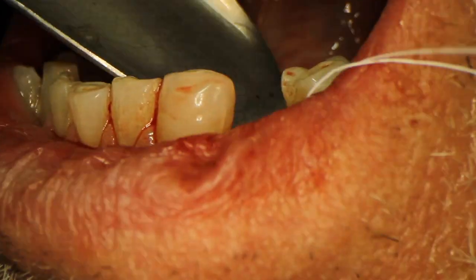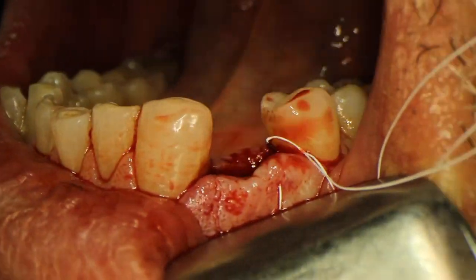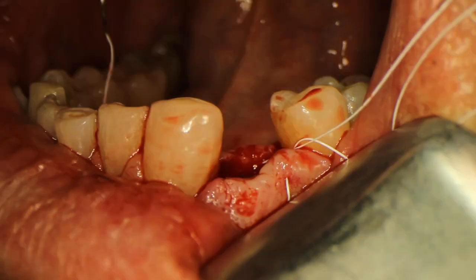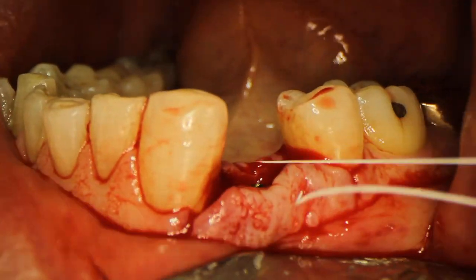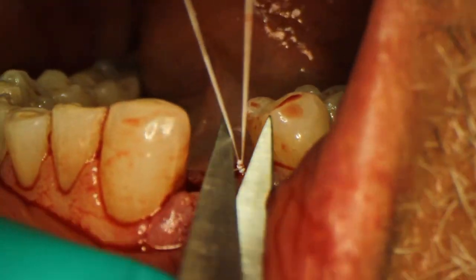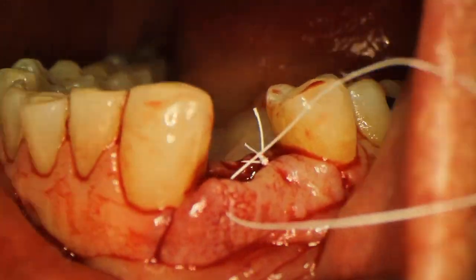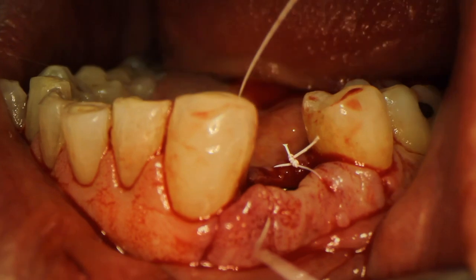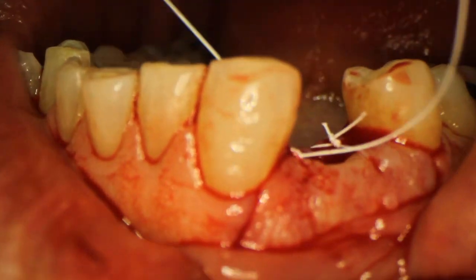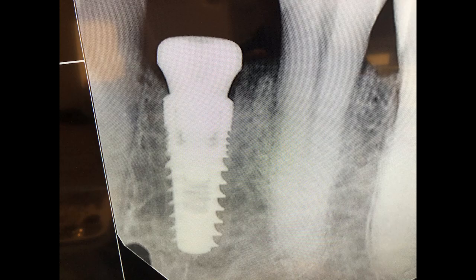The healing abutment is placed and now I just suture up the site with some PTFE sutures, and we're going to wait three months before restoring. Here is the final x-ray — you can see that everything looks pretty good and that implant is going to heal up nicely.